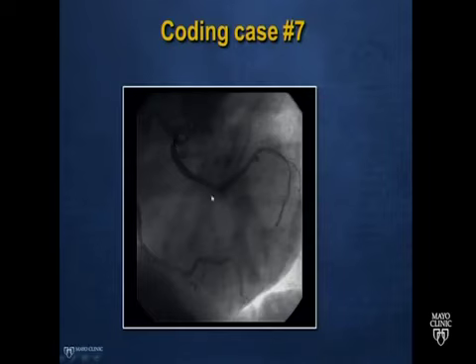The second thing I want to emphasize is this stump here. So again, look for those hazy stumps here. We could have given you a clue of a vignette of a patient with an ACS, but this is a stump, this is a complete occlusion. So if you see an area where there aren't any vessels, again, look for stumps and complete occlusions.